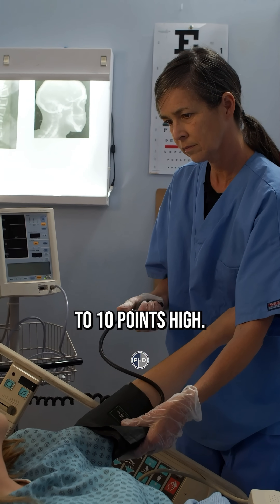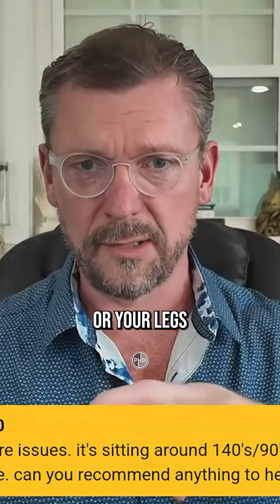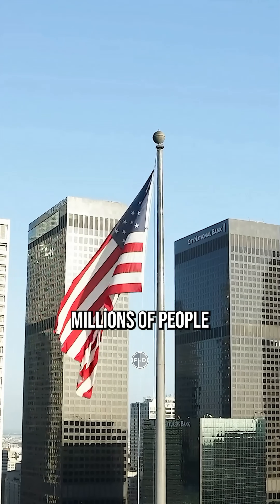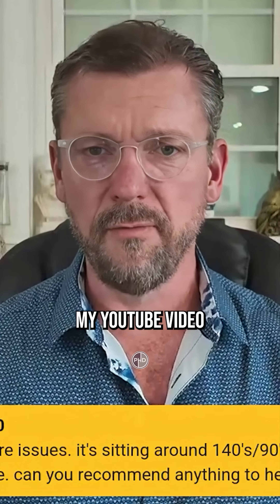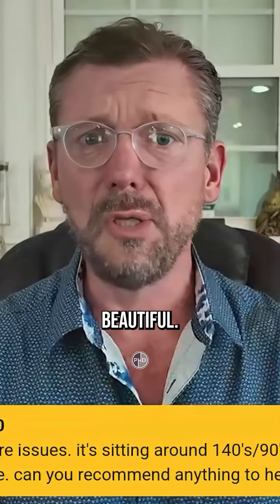Your blood pressure is going to be anywhere from 10 to 20 points falsely high if you do that. If you've got to pee, it'll be 5 to 10 points falsely high. If your feet are dangling or your legs are crossed, it can be 5 to 10 points falsely high. There are millions of people in the United States right now taking blood pressure medicine who don't even have high blood pressure — because when they watch my YouTube video and check it properly at home, their blood pressure is beautiful.